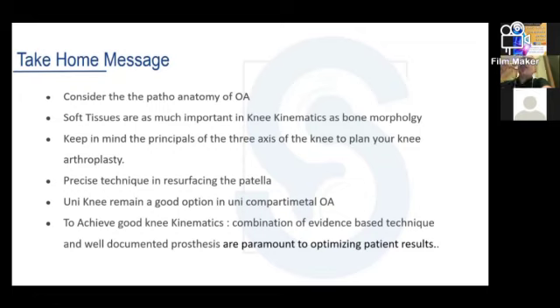What does this mean? If you have a supracondylar fracture, for example, and you have displacement in recurvatum of the distal femur, then you have to put the prosthesis in the initial position, not put the femoral component on the femur in the recurvatum situation. You have to put your femoral component in a more flexed position to give the knee the correct position. So you have to separate two situations.